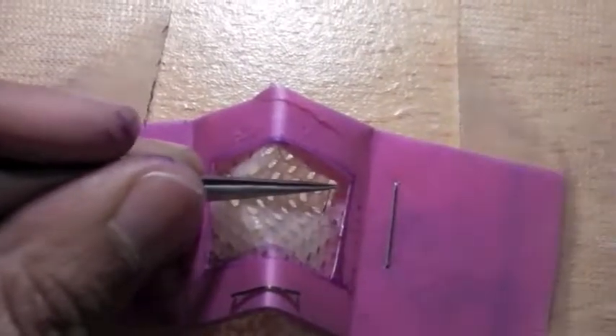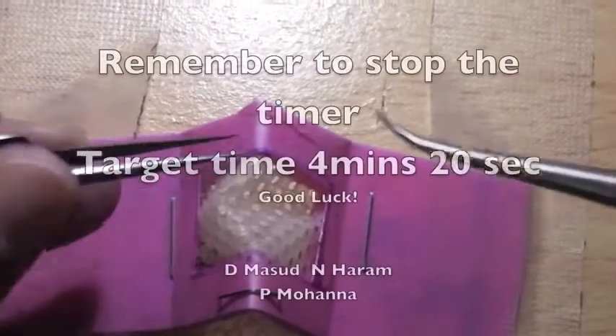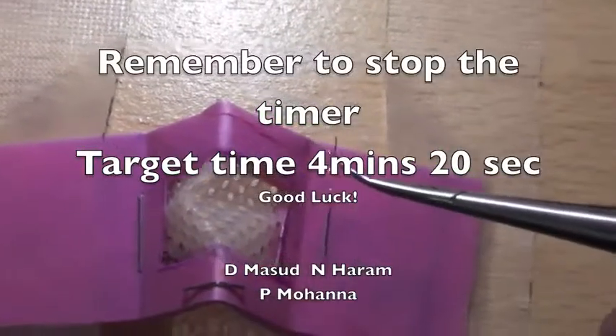As you're nearing the end, remember to press stop on your timer. Good luck — it's done.